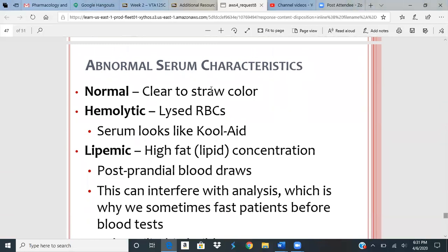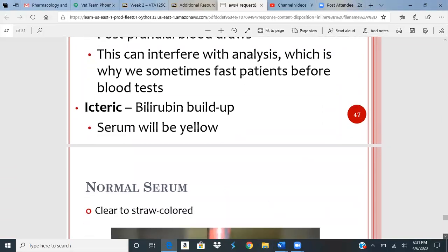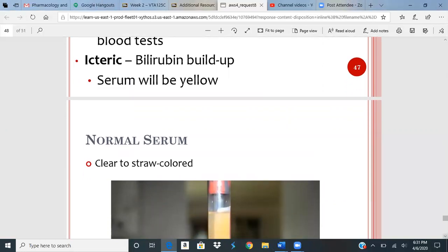So normal serum, again, needs to look like straw. If it's hemolytic, that means we've lysed the red blood cells, and it kind of looks like Kool-Aid. If it's lipemic, usually that means the patient just ate. Most of these panels are supposed to be fasted panels like in human medicine. Of course, with animals, that doesn't always happen, so we can still draw the blood. It just may be lipemic, which just means that there's lipids in it. There's fat from the food they just ate. And then icteric, bilirubin buildup. You can definitely tell when it's not the right color.